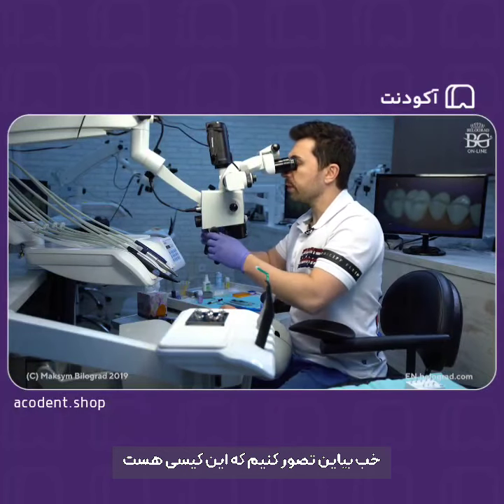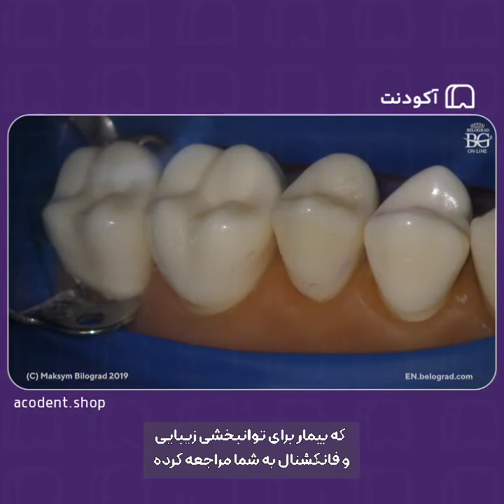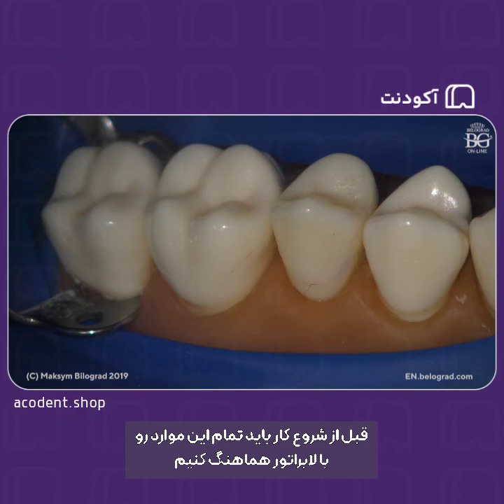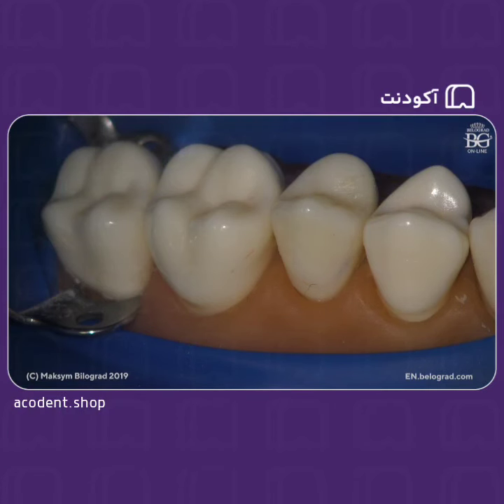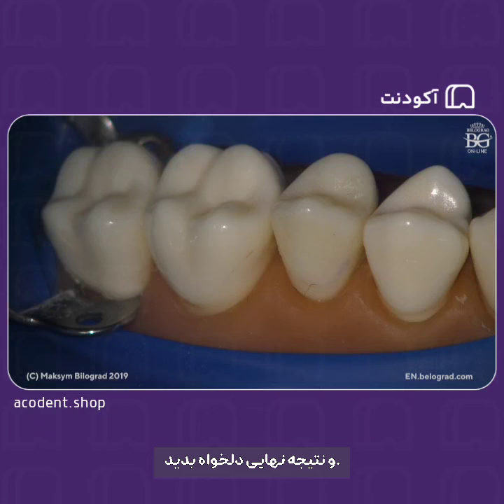Okay, so let us assume this is the case when a patient comes for aesthetic and functional rehabilitation, and he or she would like to get teeth whiter, and we would like to improve the aesthetic outcome of the patient's smile. We have to discuss everything with the dental technician before we start the case, because the one who is responsible for color change is our dental technician. You have to provide your dental technician enough information to understand the initial situation and also what kind of outcome you would like to achieve as the final result.